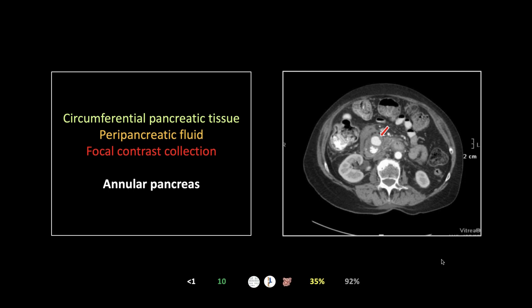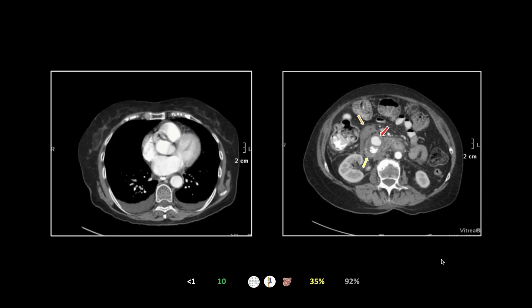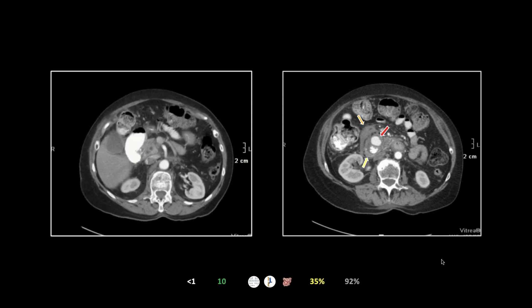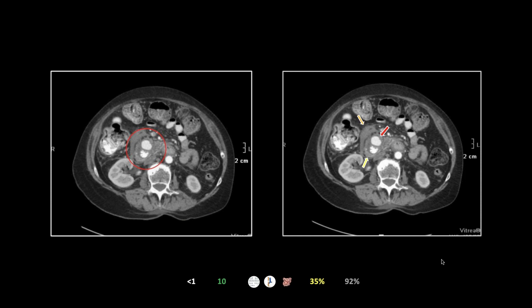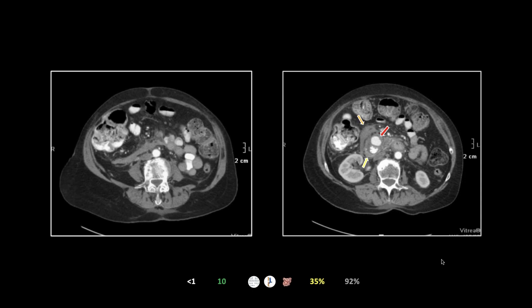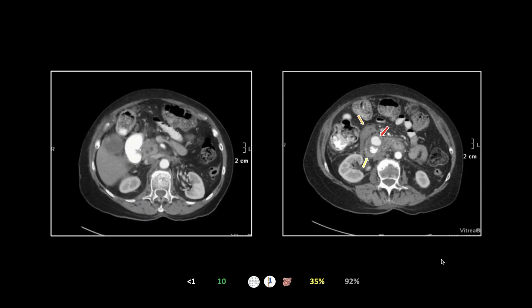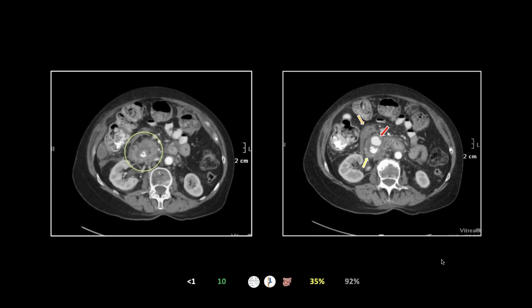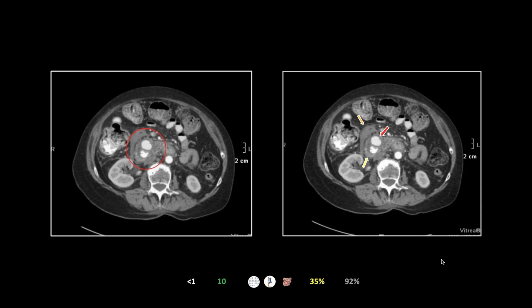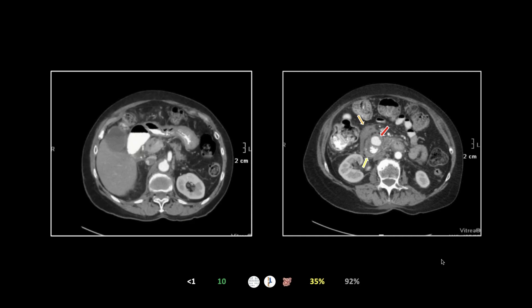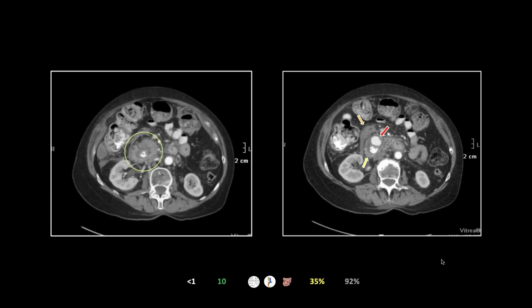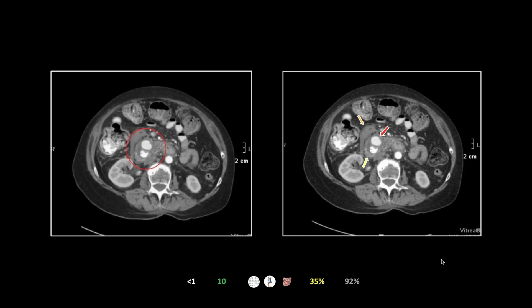There is a rim of pancreatic tissue surrounding the duodenum, significantly narrowing its lumen. There is peripancreatic and periduodenal fluid, and within the wall of the duodenum there is a focal contrast collection — essentially a pseudoaneurysm. The significant obstruction likely increased the exposure of this duodenal mucosa to acid, which eroded into it and created that pseudoaneurysm, causing periduodenal bleeding and stranding. On the movie, track the slightly dilated duodenum pinching down with pancreatic tissue forming a perfect donut around it.